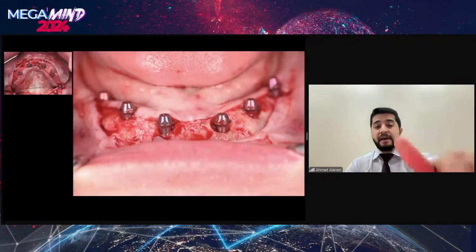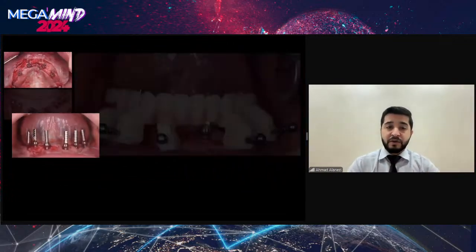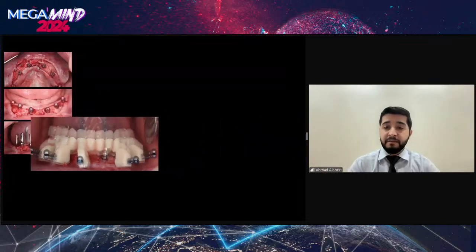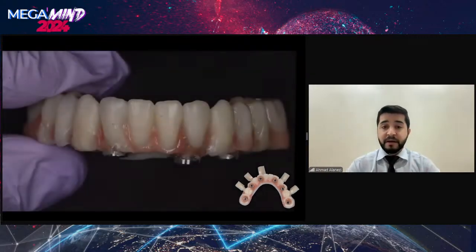We placed our multi-unit abutment. We made sure that I have enough space around our multi-unit abutment. Our temp cylinders were also placed. Our prostheses were placed and picked. And as you can see, they are exiting from our predetermined channels.